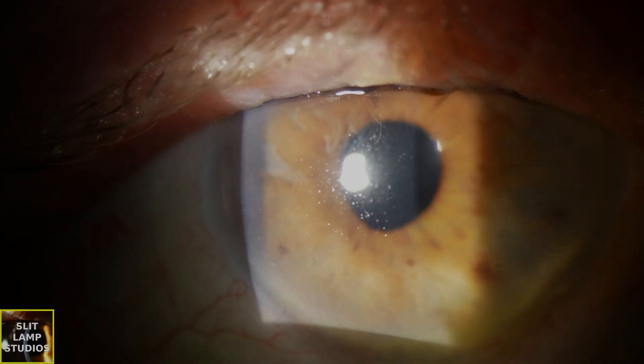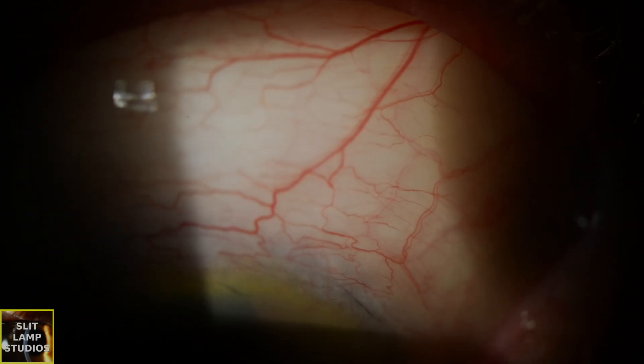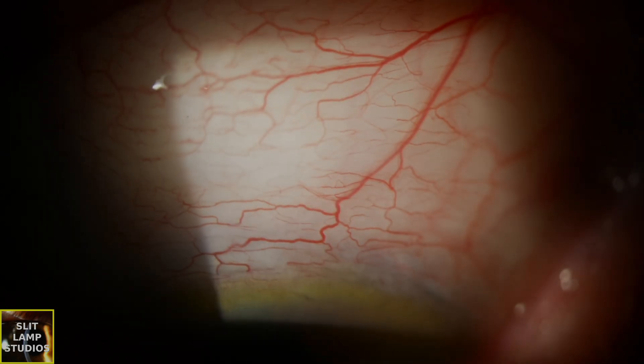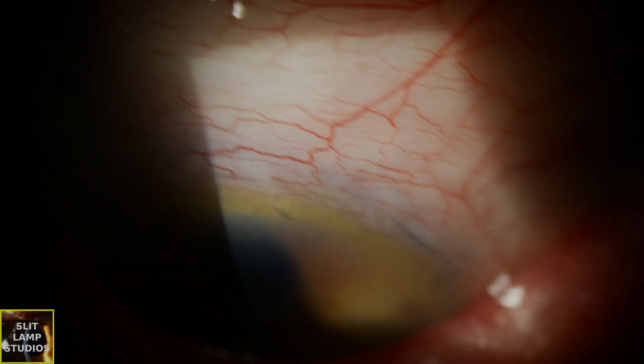In contrast, a flat, hypervascular, or cystic bleb may signal some failure or scarring. Here we do have some vascular changes and the bleb is relatively flat, but it's not so cystic. The pressure is 12, so we can be relatively happy with this.